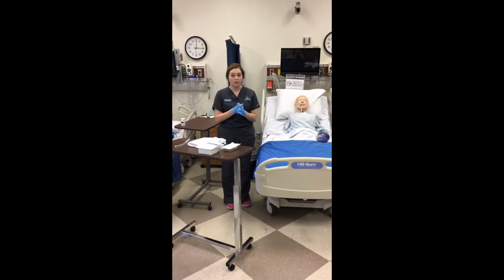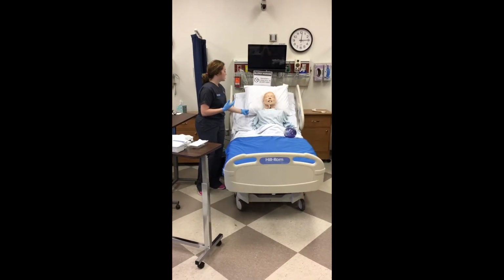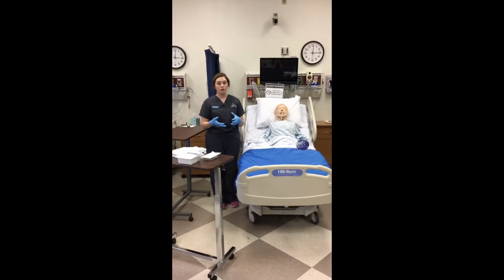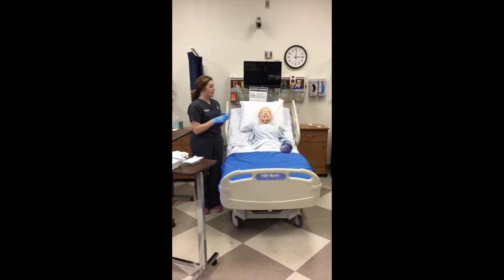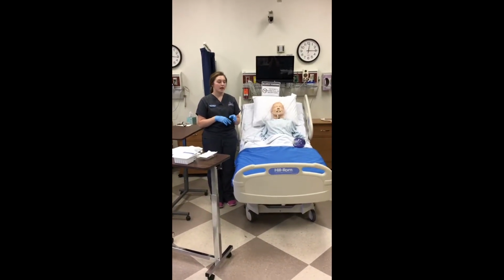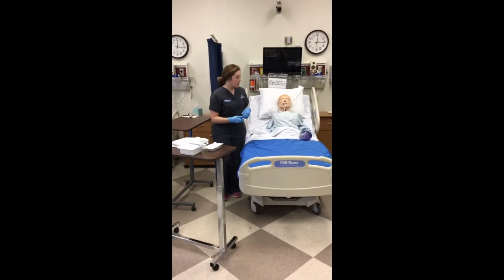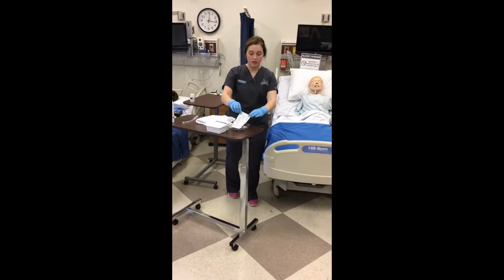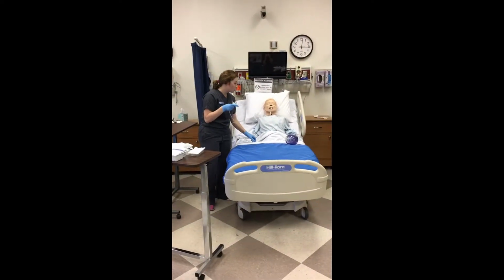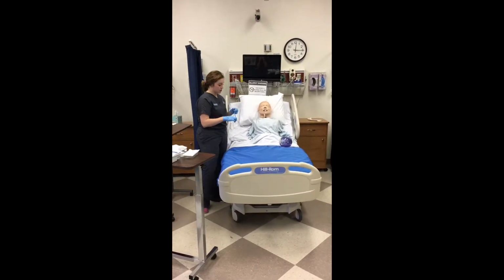It is the oropharyngeal. You're going to want to again go into your patient's room, assess them for any signs and symptoms of decreased breathing or need for suctioning. You're going to identify yourself to the patient, identify the patient with 2 patient identifiers, provide privacy again, hand hygiene, all the same kind of stuff. The only difference is this time you're going to be using suction tubing that looks like this.